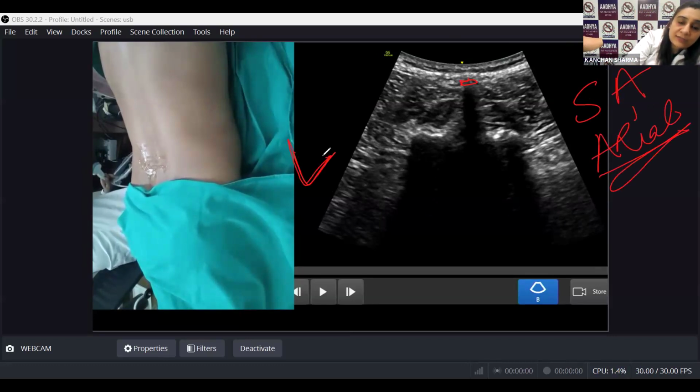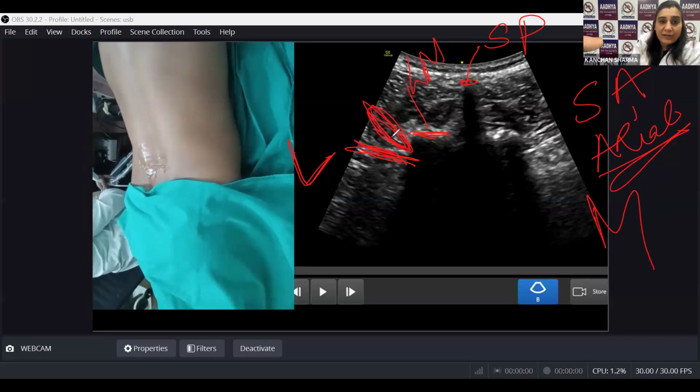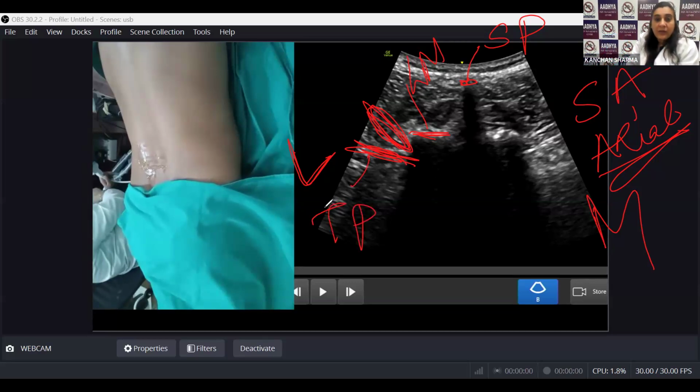Aspect marker is towards the lateral side and this is the medial side, okay? Now I'm able to see this one here, right? So this is going to be your spinous process. This will be your lamina. Somewhere here, you are going to have the junction, your facet joint, I should say, the junction of your inferior and the superior articular process. And this is your TP, right?